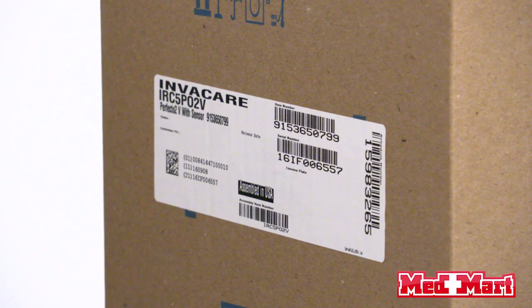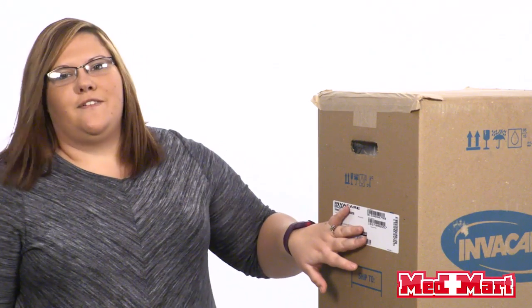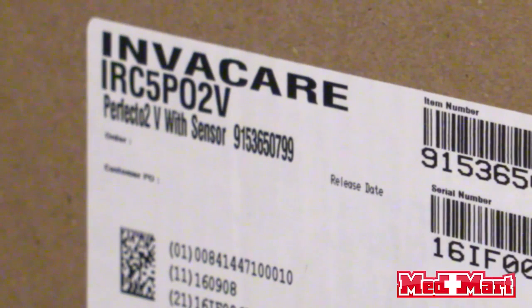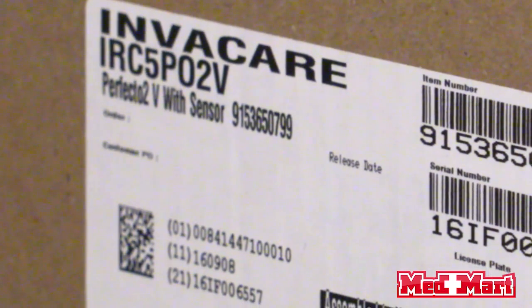On the side of the package there are a few items you want to take note of. Here you're going to have your serial number — you're going to want to write that down for future reference. It's also going to tell you the type of concentrator you ordered and what has been sent to you. You want to keep the package for future reference if you need to refer back to it for any warranty issues.